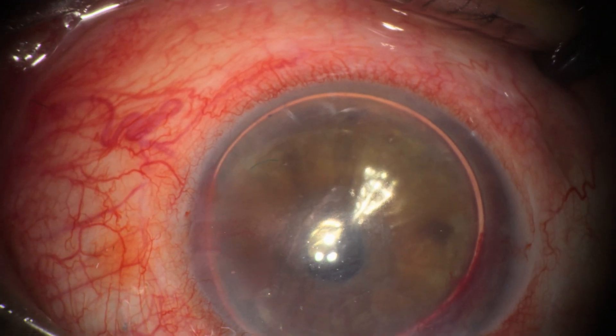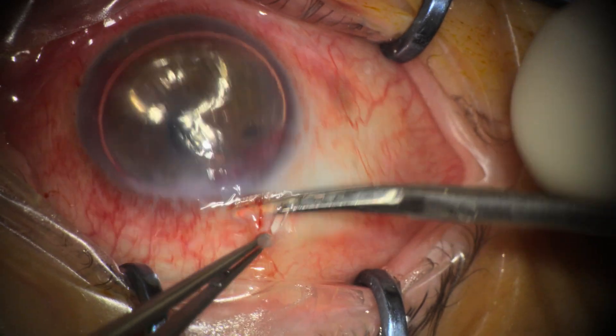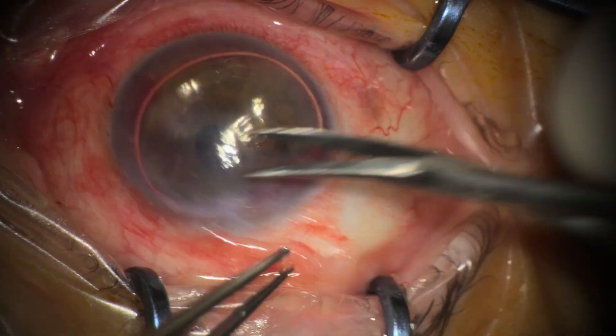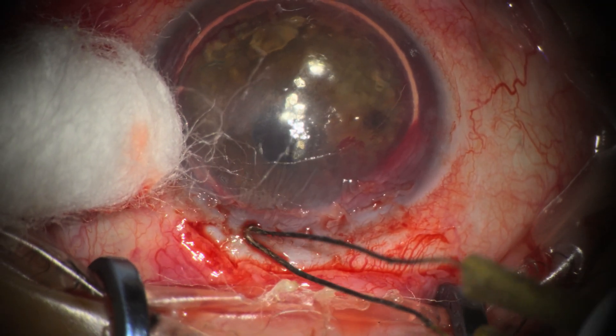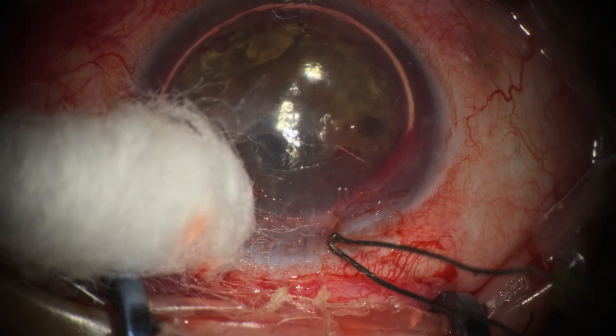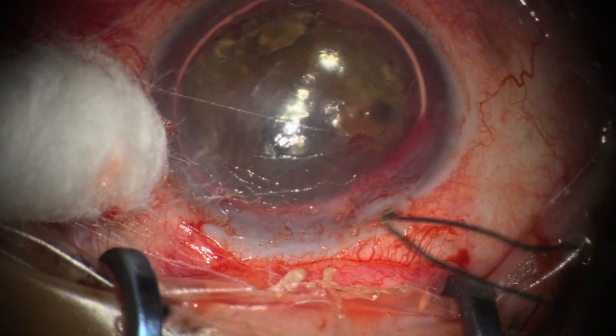We're also opening up the old SICS wound to apply cautery and inject an anti-VEGF agent to try to prevent recurrence and regrowth of the neovascularization.